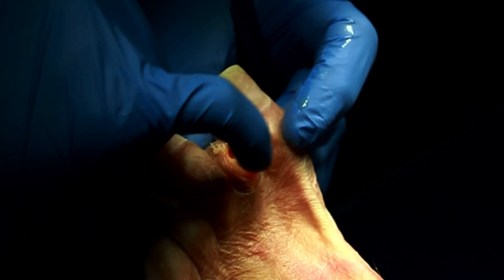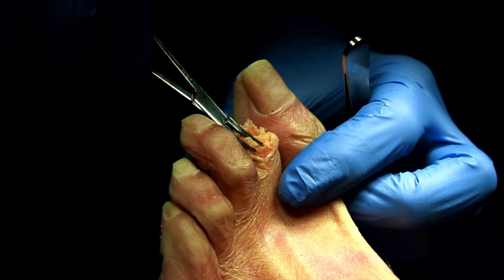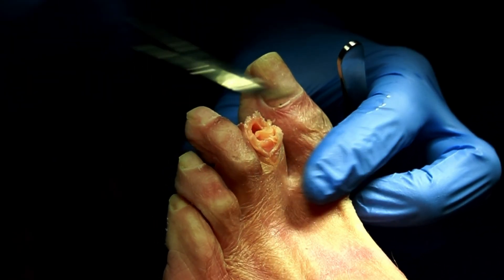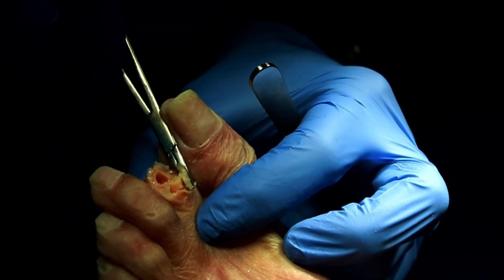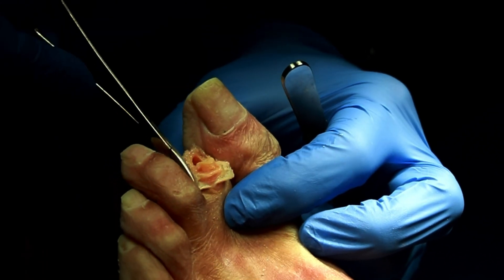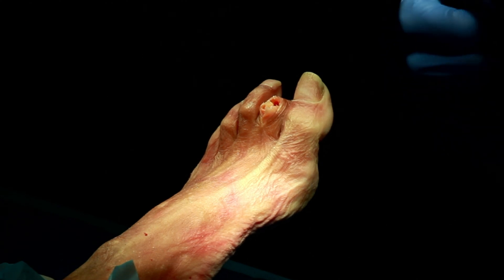It's important at this point to remove any bone on the larger phalanx around the edges to allow it to come together. In this case a rongeur would be best — use a small hemostat to break away that little bit of bone on the edge, and also on the outside edge too, to make sure there's no residual bone and it's nice and flush around the edges.